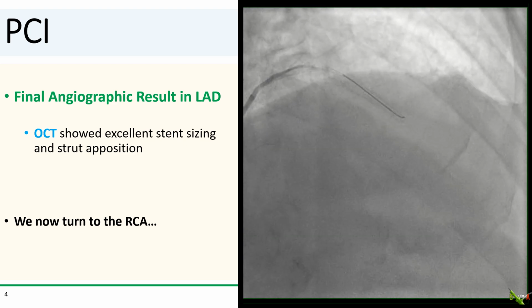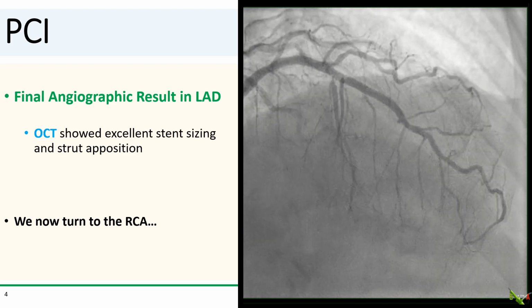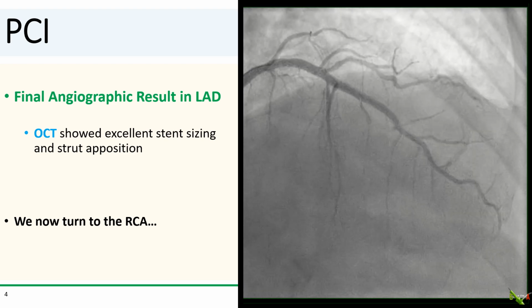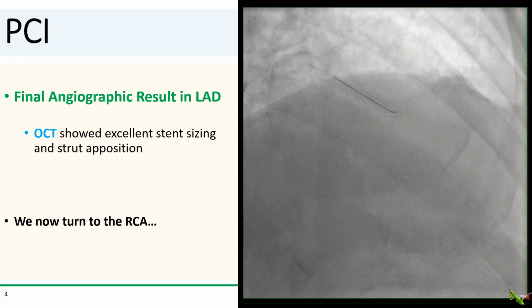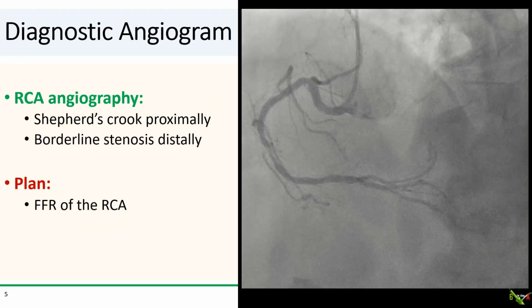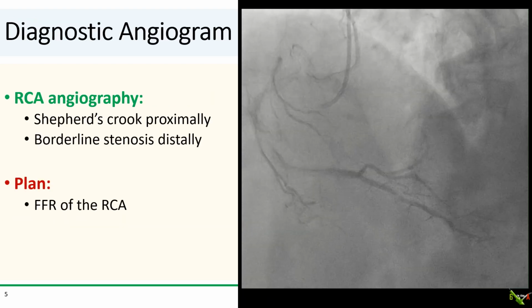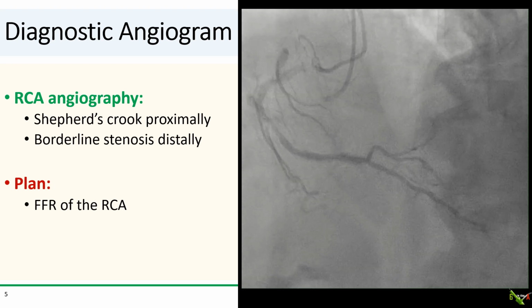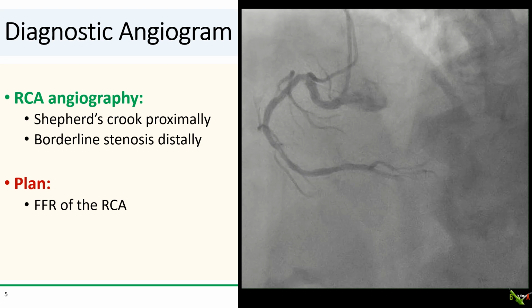The OCT showed excellent stent sizing and strut apposition, and we now turn to the RCA. So here's what the RCA looks like. There is a shepherd's crook proximally, and there is a borderline 50 to 60% stenosis distally.